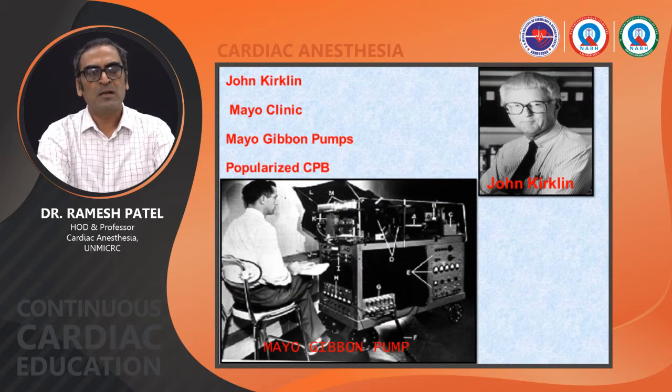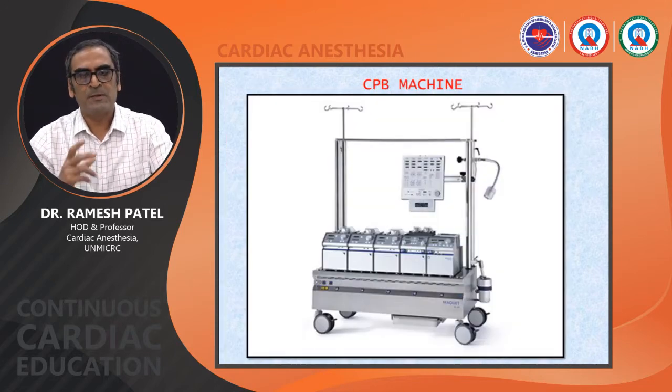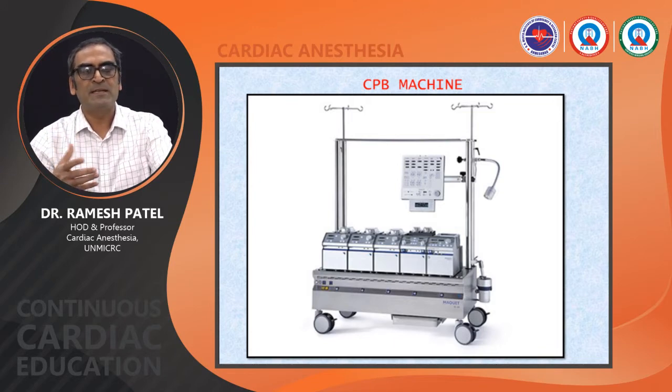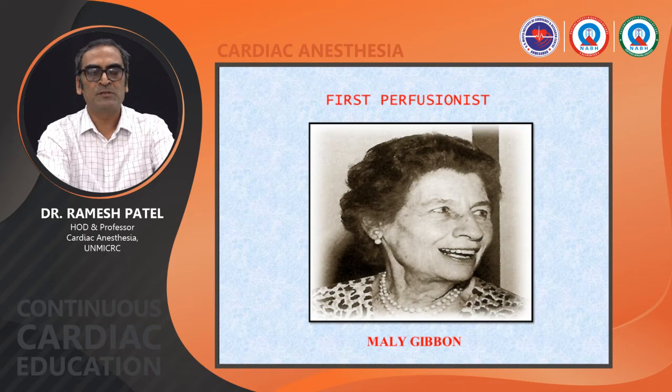After that, John Kirklin was also involved in the development of the cardiopulmonary bypass machine, and the machine is called the Mayo-Gibbon pump. And this is the picture of the CPB machine that we are using nowadays. It is quite compact, sensitive, and compatible with advanced monitoring systems. She is the first perfusionist, Mary Gibbon.